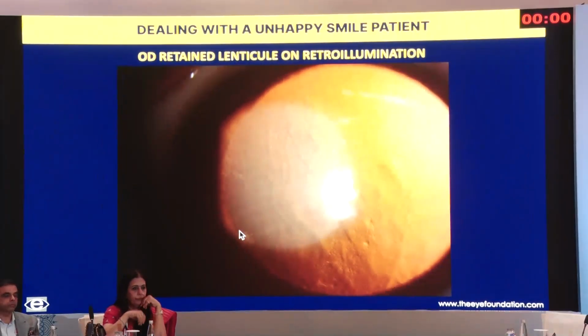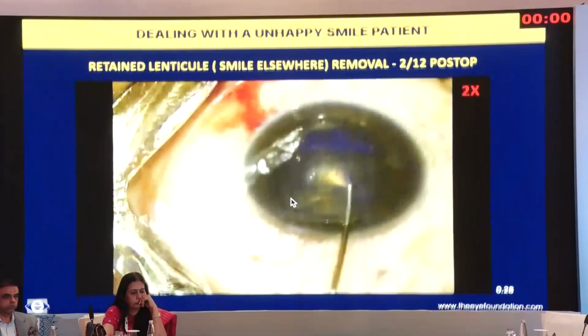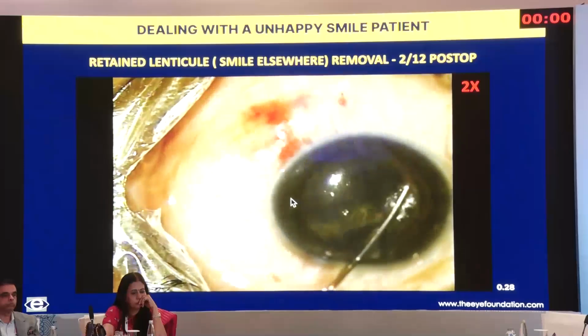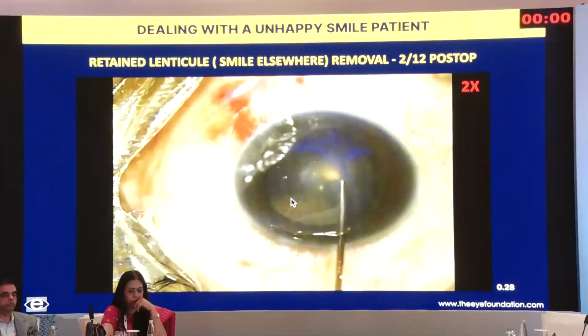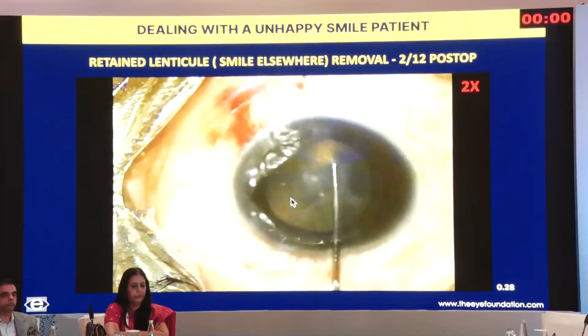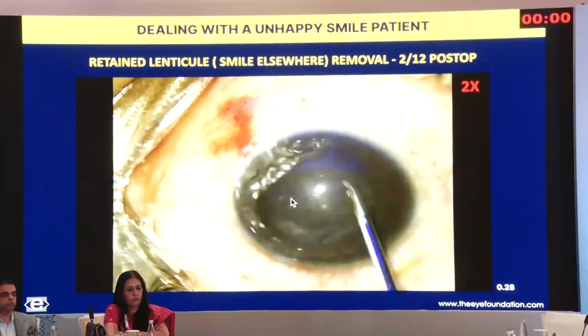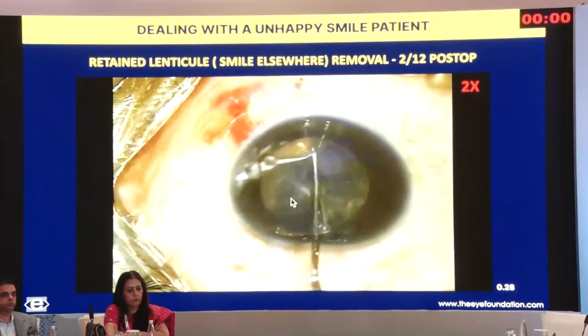And most importantly, just in case you don't have access to these things, just a dilatation and a simple slit lamp examination shows in retroillumination that you have a clear cornea here, while in the area where there is a residual lenticule, there is a very rugose picture that is seen because of the disturbance in the corneal texture. So essentially we just went back again, did not have to use triamcinolone because here we knew exactly where to look for the lenticule, and this is being opened up almost 2 months after the primary surgery, and that's the lenticule that's being taken out.